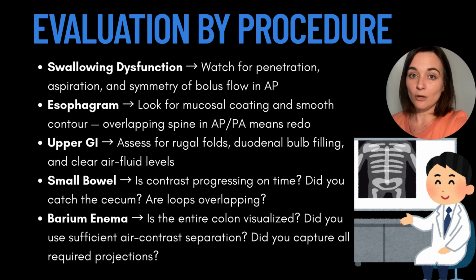In the small bowel, is the contrast progressing on time? Did you catch the cecum? Are loops overlapping? In the barium enema, is the entire colon visualized? Did you use sufficient air contrast separation? Did you capture all required projections?